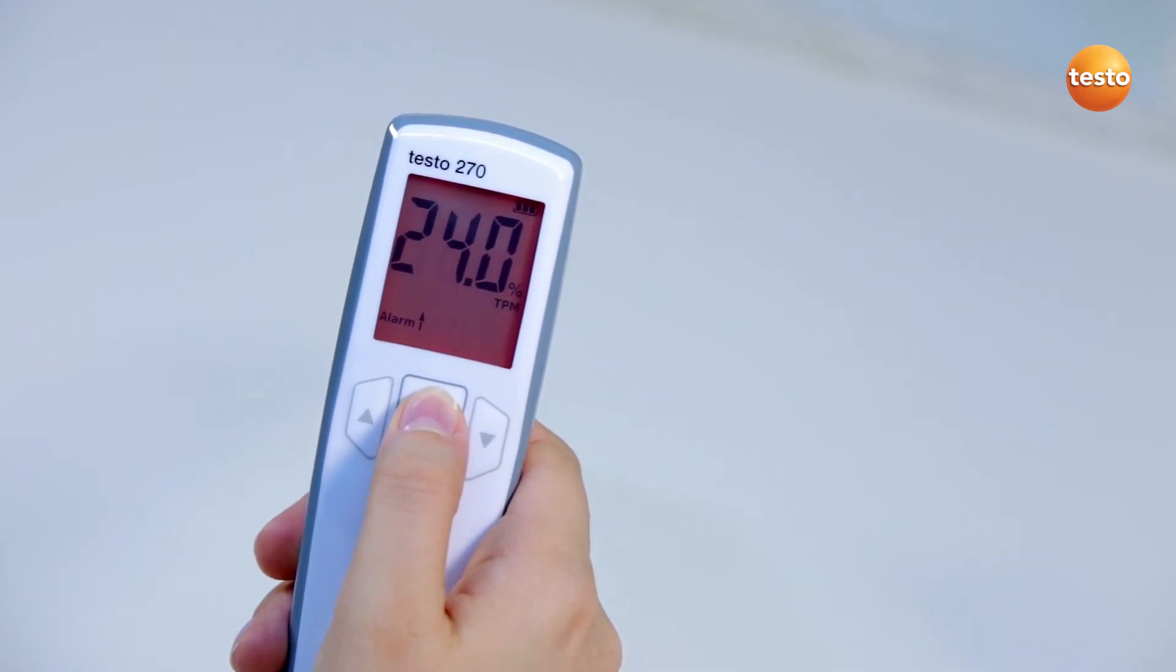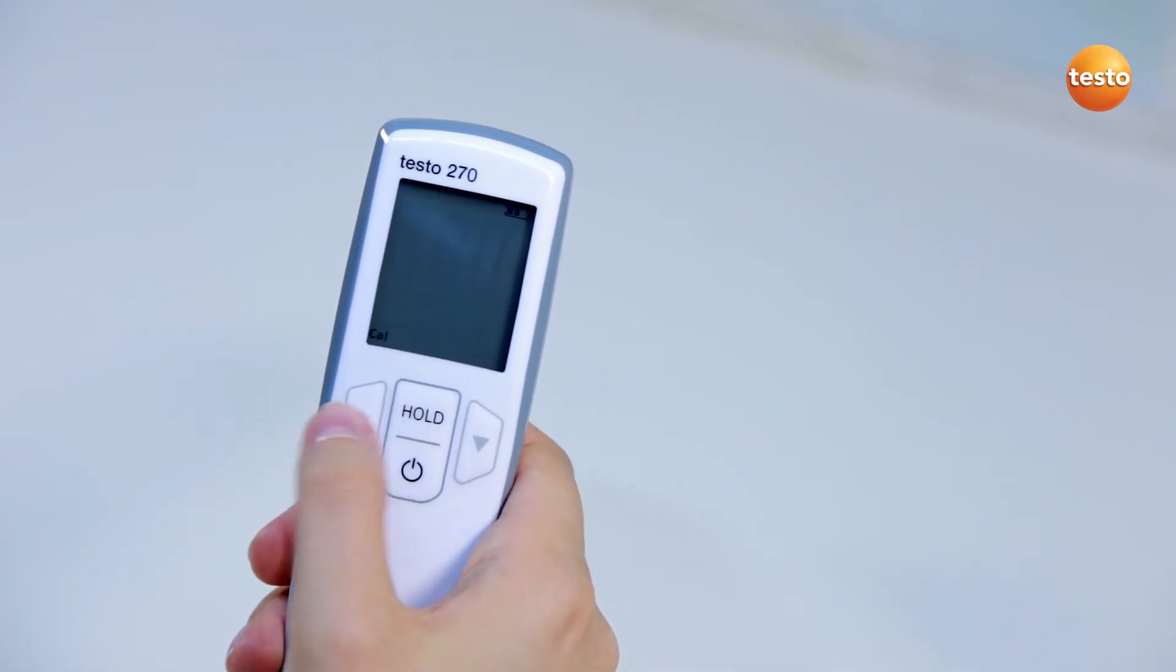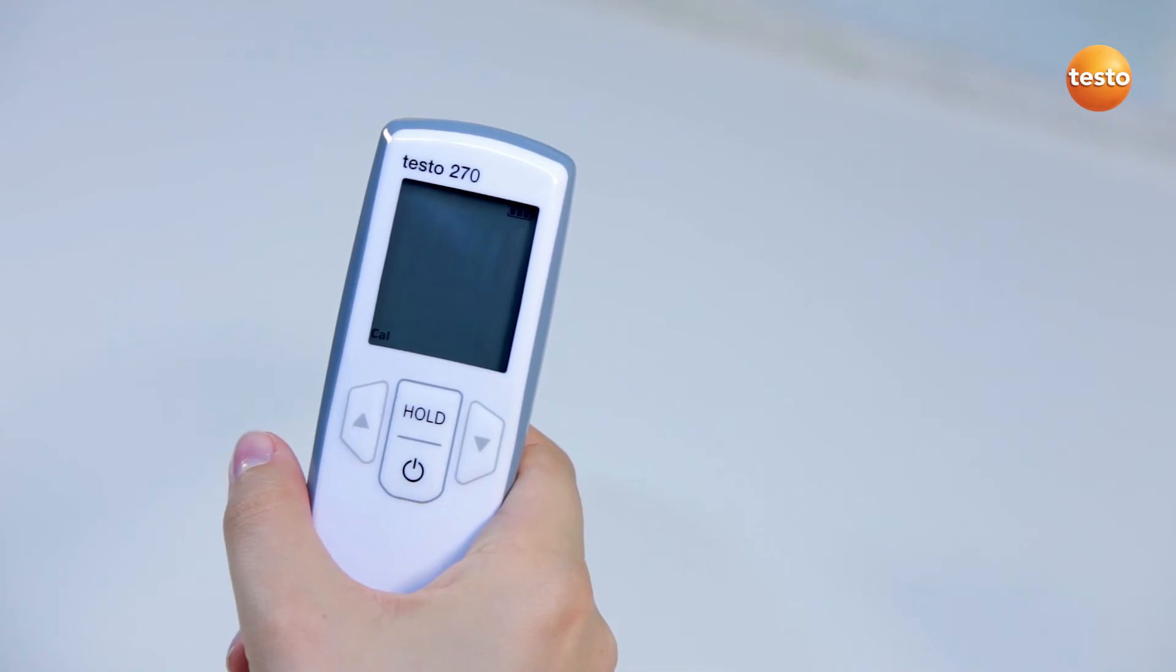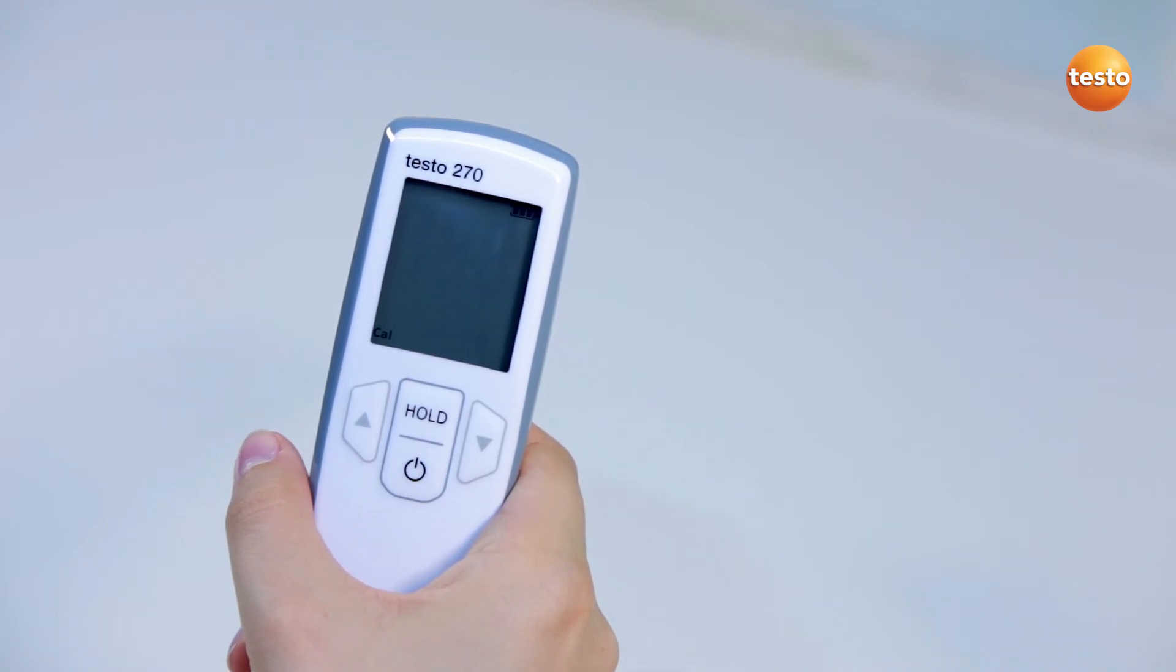To save the adjustments, I confirm with the hold button as before. Only then are the settings for both TPM limit values accepted.